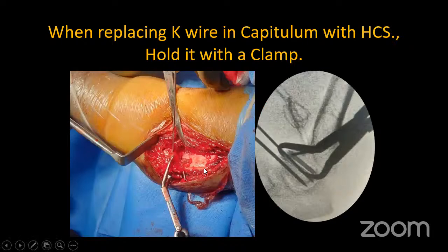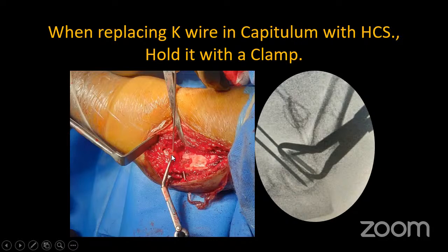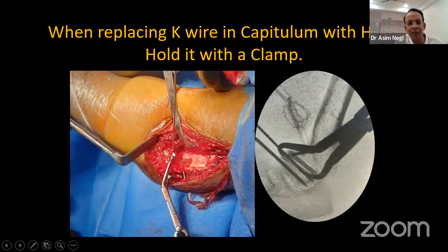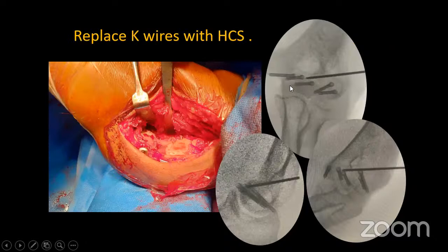when you are replacing this capitular K-wire with the headless compression screw, because it's only a single wire, it tends to rotate. So you have to use a clamp. Put the prong of the clamp on the capitulum here and on the posterior intact cortex, so that when you replace this K-wire with the headless compression screw, it doesn't rotate and disturb your reduction. So this clamp is holding it like this. You replace the K-wire with the headless compression screw, 2.4 mm. And now you can see that there are 5 headless compression screws total.